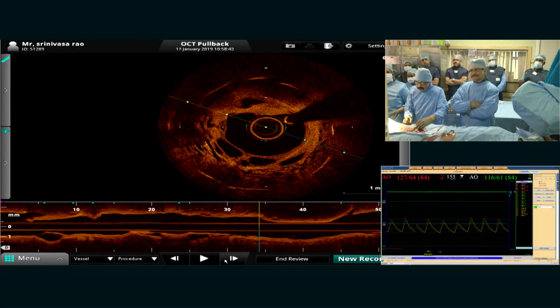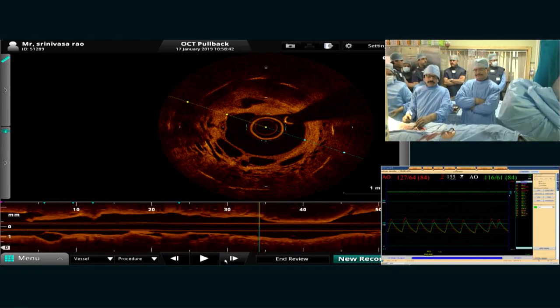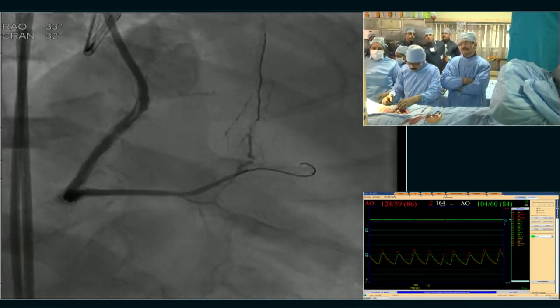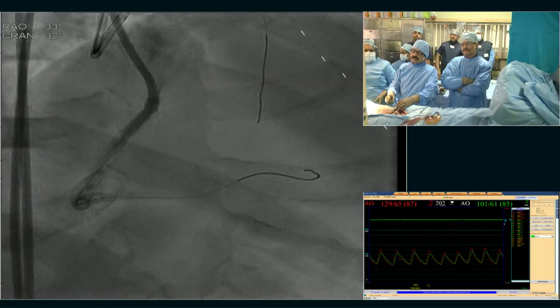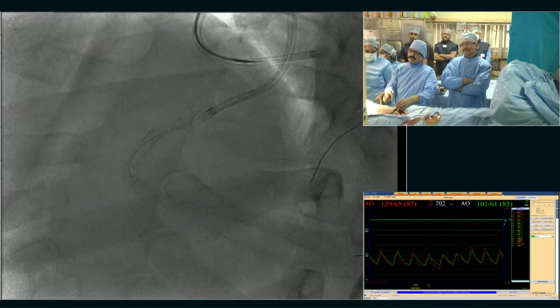We got here a Magic Touch balloon, a sirolimus balloon, which we quite often use here. We got the distal stent is around 3. There are 3 stents here. The distal one is 3 into 37, put a long time, 3 years back. So we are doing a DEB with a 3 into 40 balloon for the distal segment.